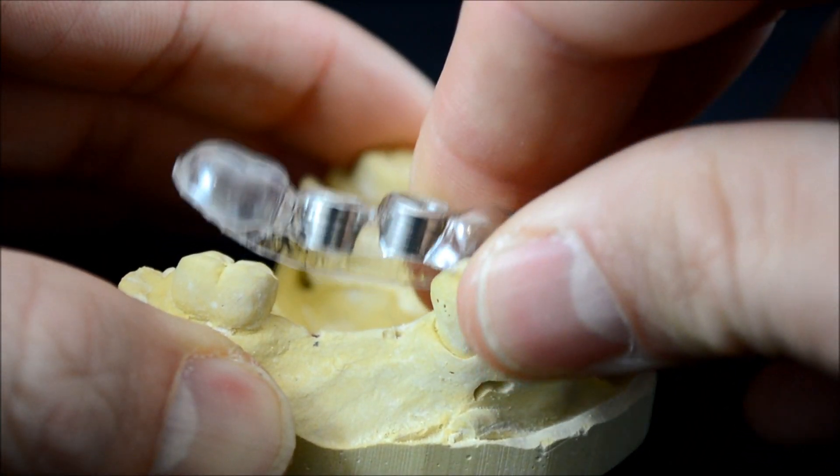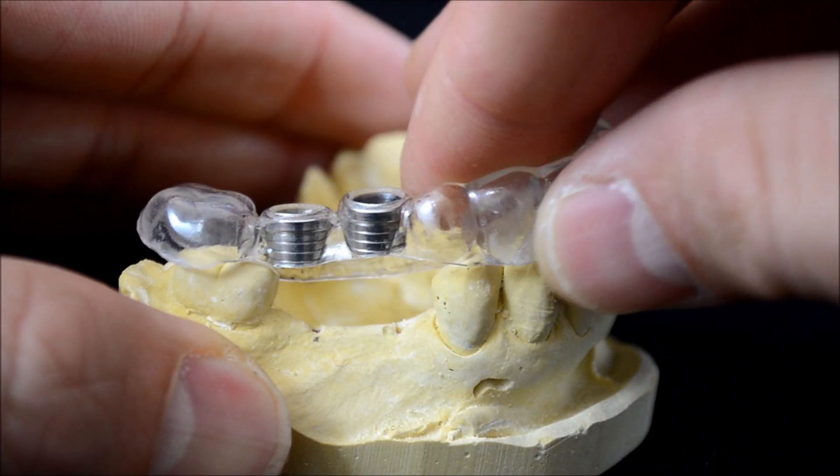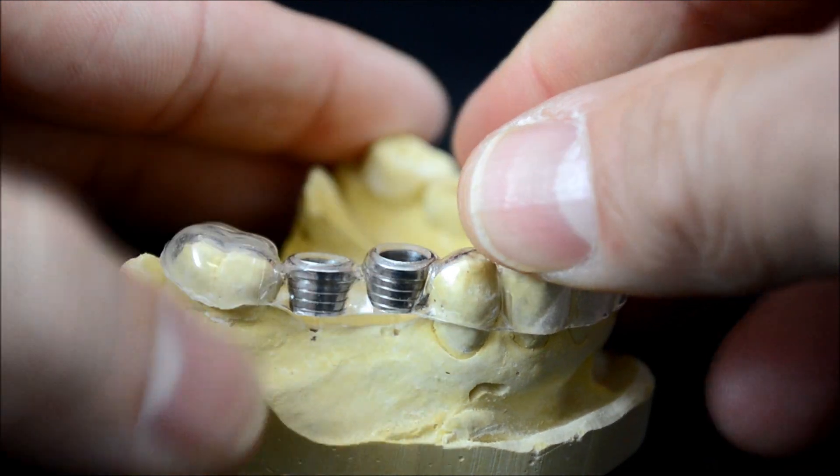At this point you may like to remove the guide and ensure you are satisfied with the entry points you had planned. Notice how retentive the guide is. This would also be the time to reflect a flap if needed.